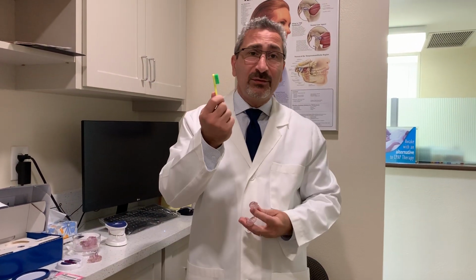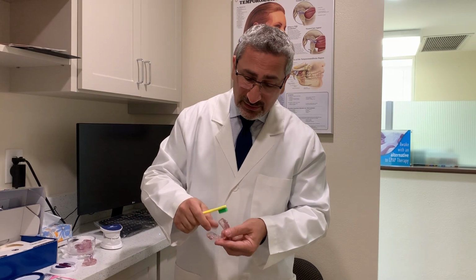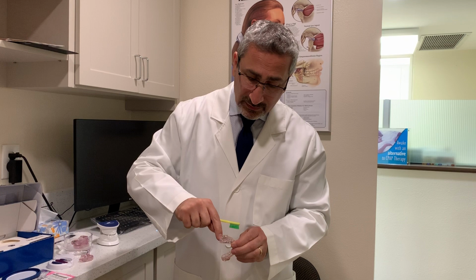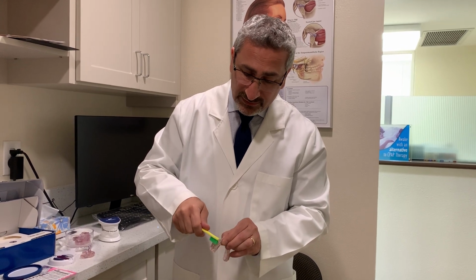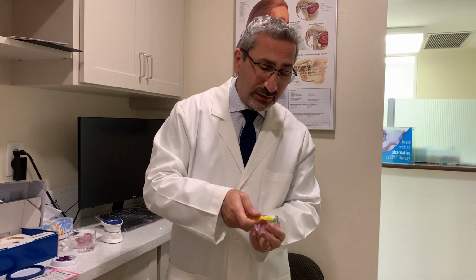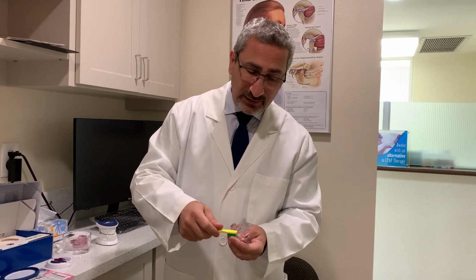So any toothbrush, just make sure you get in there all along the inside, all around the cracks where there could be potential places where the plaque and bacteria can be getting, even around the wings here and on the inside.